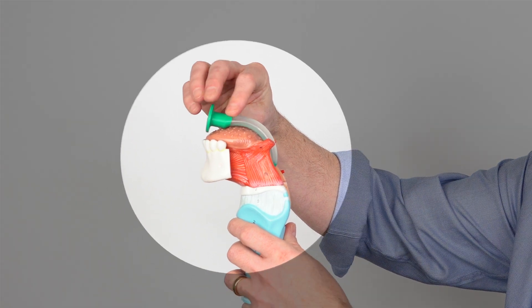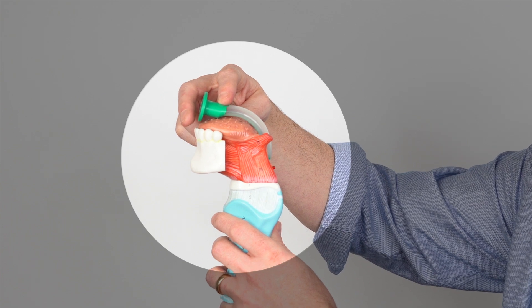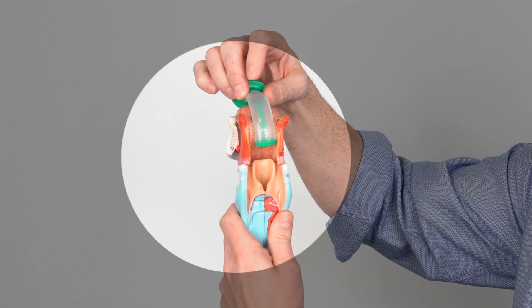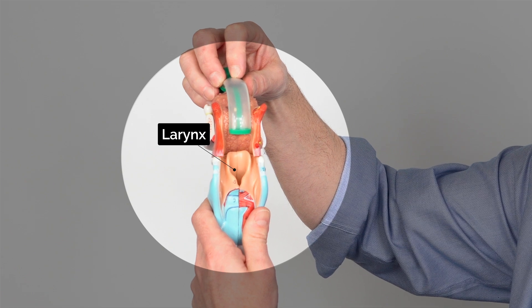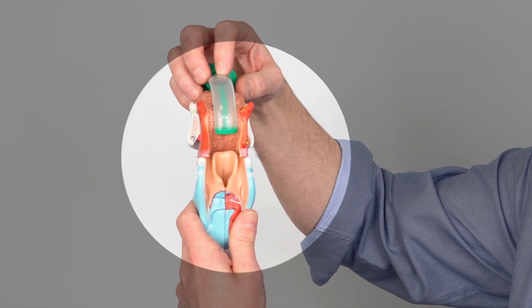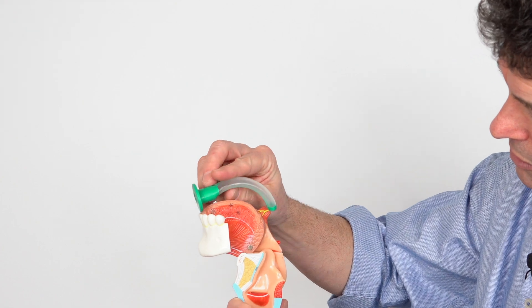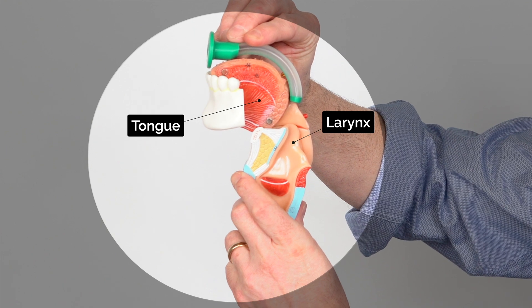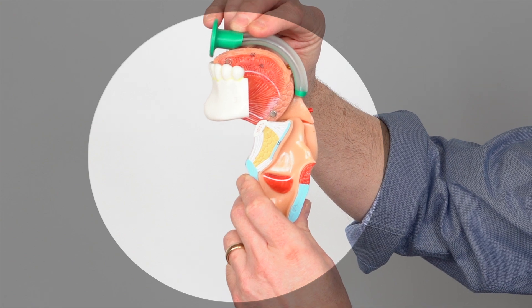The oropharyngeal airway will sit over the top of the tongue with the flange in between the teeth and the lips. At the back you can see where the distal end of the tube sits just above the larynx, meaning that there's going to be no obstruction of the larynx if this is sat in the right place. This will provide unobstructed passage of air from outside down into the trachea and then into the lungs.